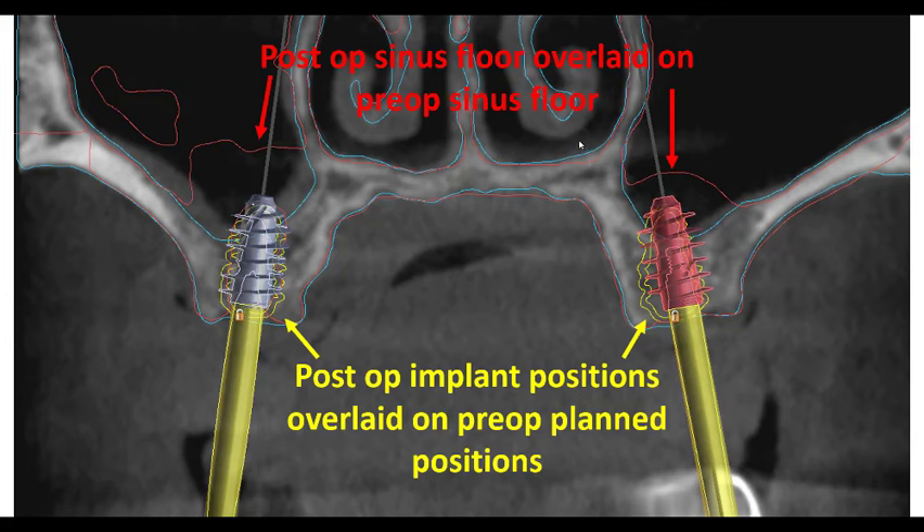I also took her postoperative maxilla and postoperative implant positions — outlined here in yellow — and the red is her postoperative maxilla. You see the exact same lifts, but it's cool to show where the implants actually ended up compared to where they were planned. Everything went in perfectly. The guide was taken off to do the lift and the implant was placed freehand. With these large diameters, we maybe had a two degree angle change, but position-wise, the depth — all of that is right on track with where we wanted it.